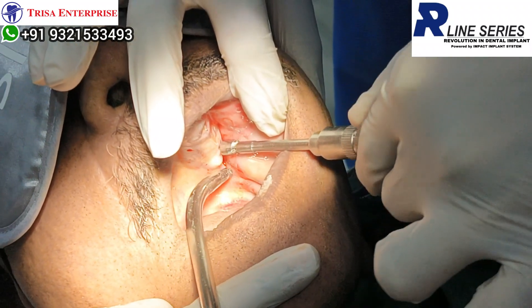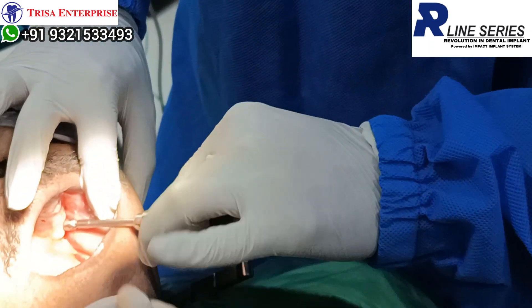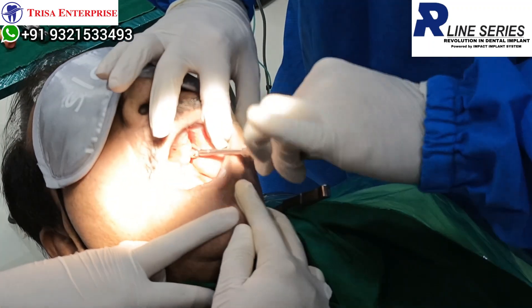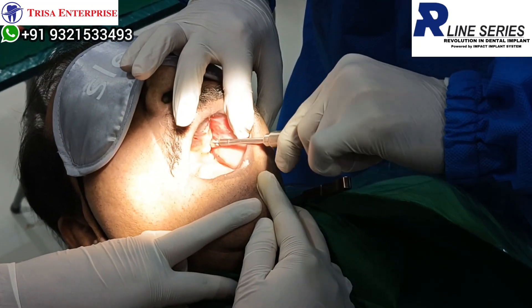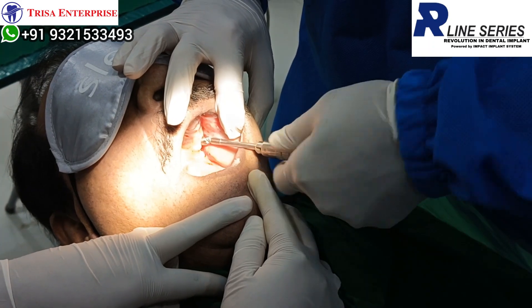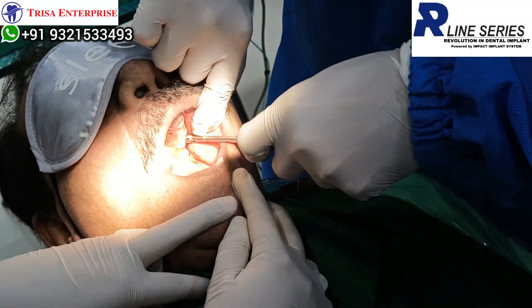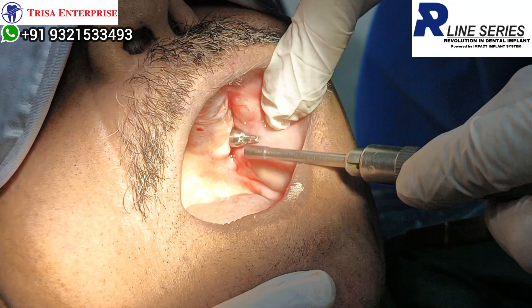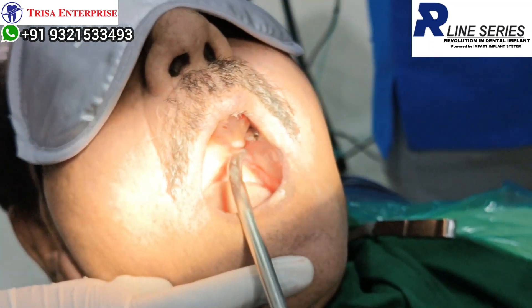As I reach the opposing cortical, I start experiencing good torque, which you can observe with the resistance coming on my hand. The design of the implant is helping me get very nice torque even though the quality of the bone was poor. Once I get my implant in, I make sure that my screw hole is in the correct position. You can see this is my screw hole over here — we must not bend the implants at all.